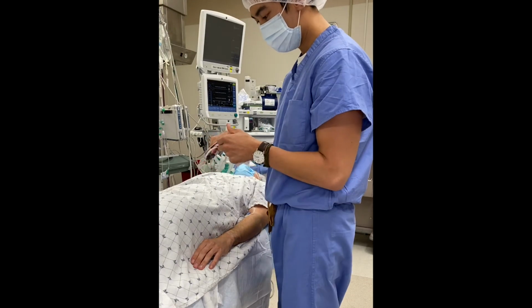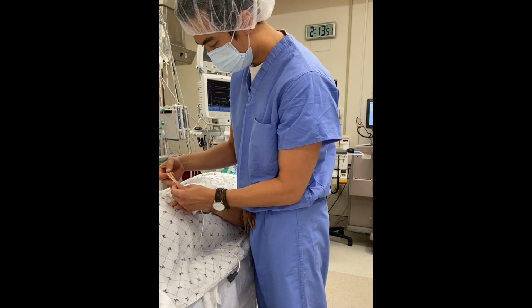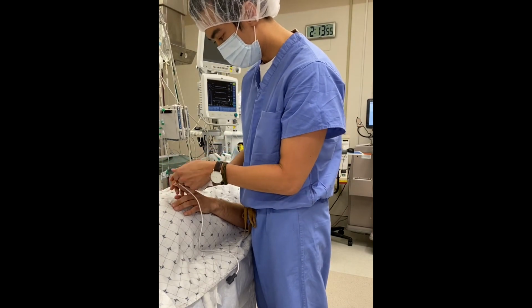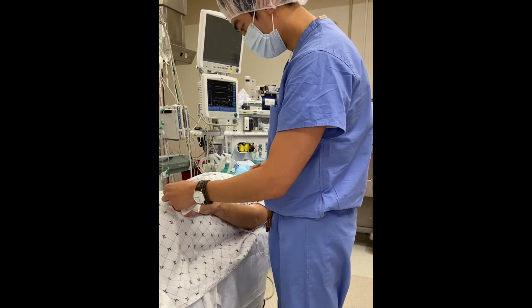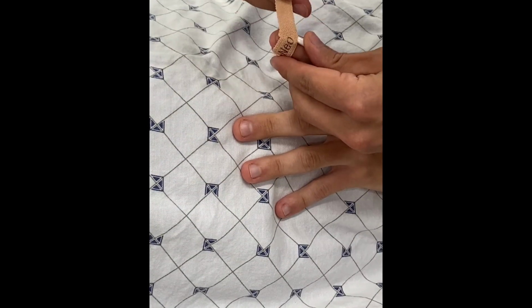Finally, the pulse oximeter is applied to the tip of one of the fingers on the same arm as the IV. Wrap the sticky band around the finger to secure it.